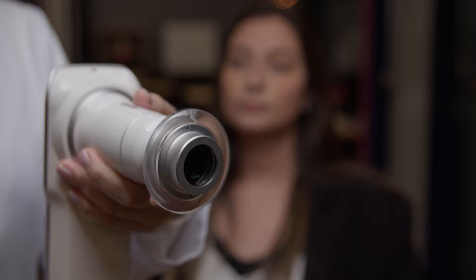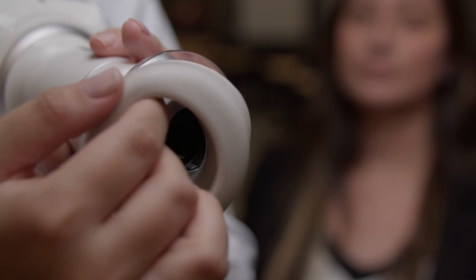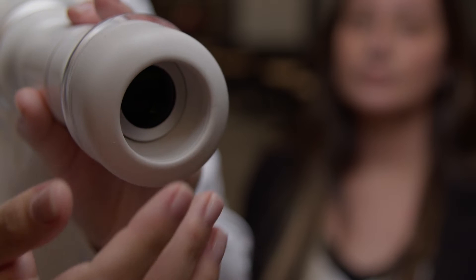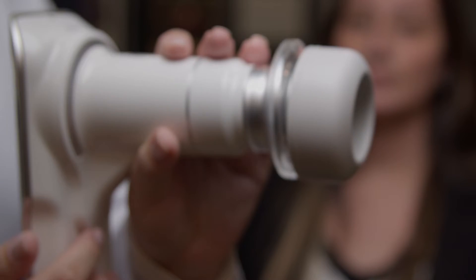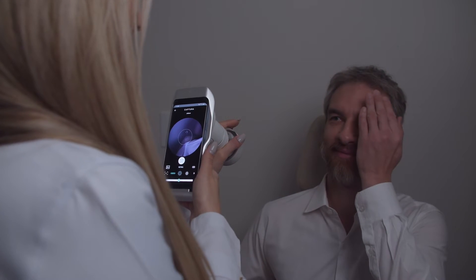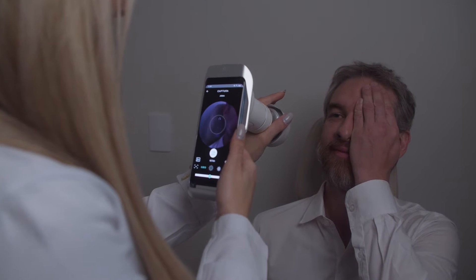Take off the lens protective cover and put on the eye cap to do the examination. This protector creates a dark space, dilating the patient's pupil naturally. The cap is optional for either a dilated pupil or the patient in a dark room.